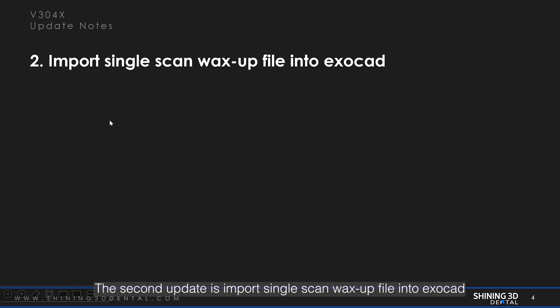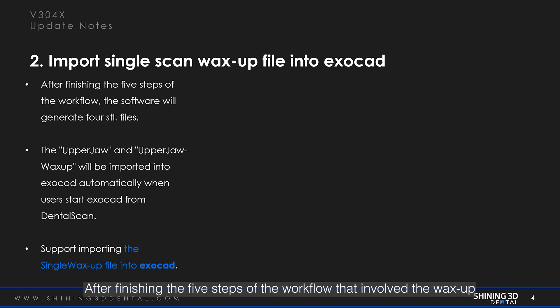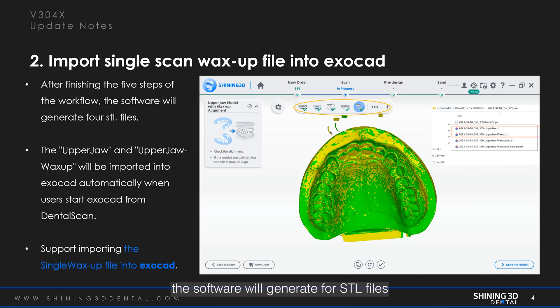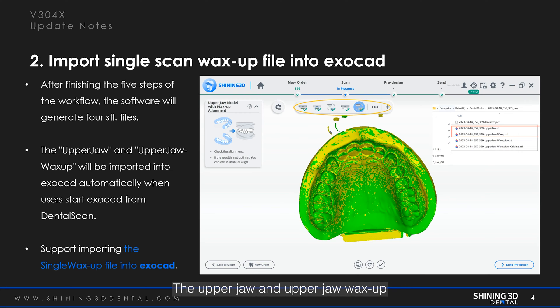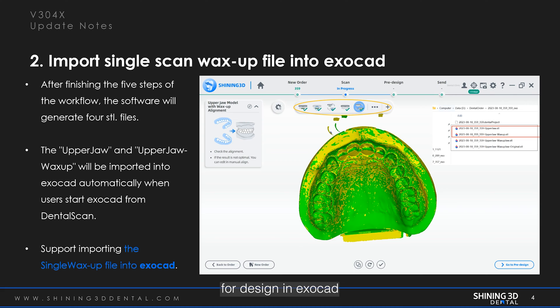The second update is importing a single scan waxup file into Exocad. In the previous version, after finishing the five steps of the workflow that involves the waxup, the software would generate four STL files. Within these four STL files, the upper jaw and upper jaw waxup would be imported into Exocad automatically. Now, we support importing the single waxup file into Exocad, which is convenient for those who need this single waxup file for design in Exocad.